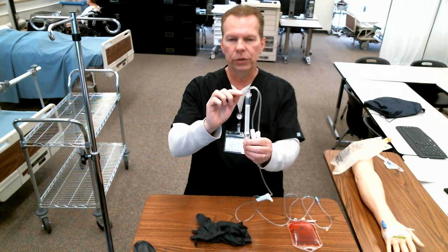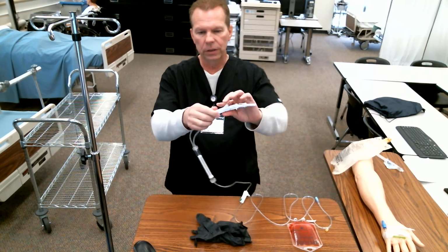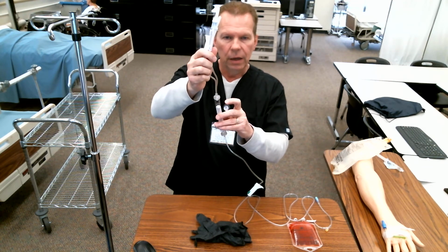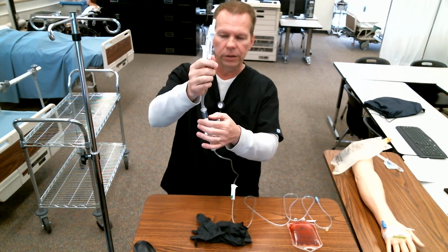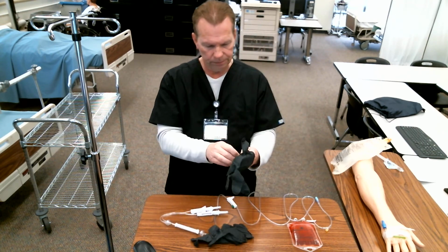And make sure that you keep solution over the top of the filter. There's a reason why. You don't want the blood coming down and dropping and hitting that hard plastic top because that will rupture the blood cells and will not do the patient any good. So make sure you monitor that and keep your solutions over that. So I'm going to go ahead and don my gloves.